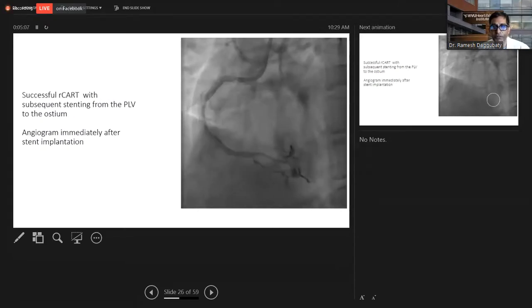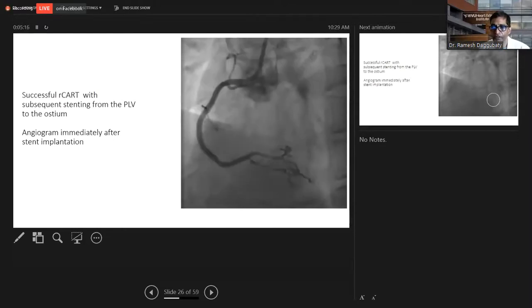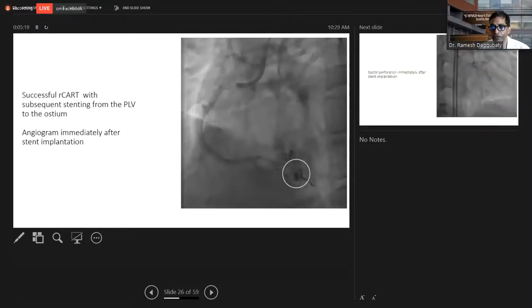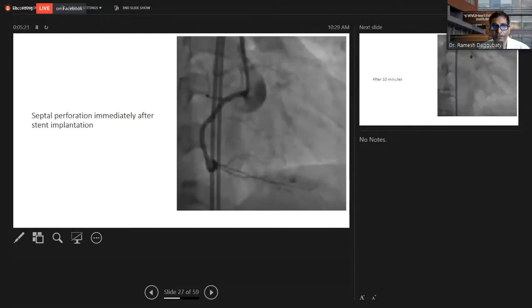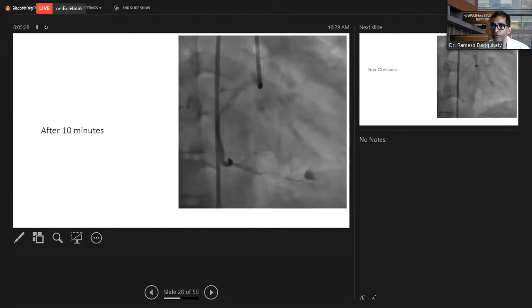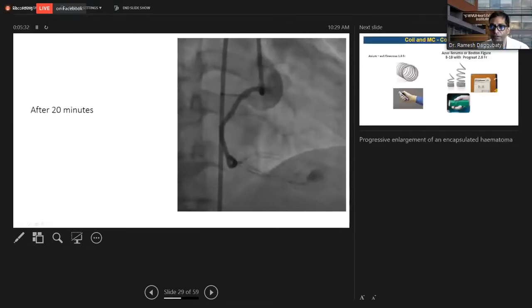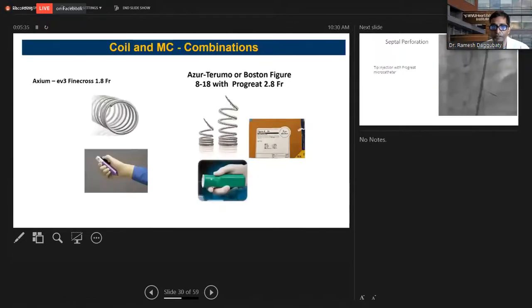This is a patient who had a successful reverse CART with subsequent stenting from the PLV to the ostium. On angiography after stent implantation, you can see in the base that there is a perforation, which is circled there. And you can see what happens to it. While we are waiting, after 10 minutes, this is what happens, and it keeps on worsening. After 20 minutes, I don't think I would wait even 20 minutes now. If you see it increasing for 5 to 10 minutes, immediately call for a coil.